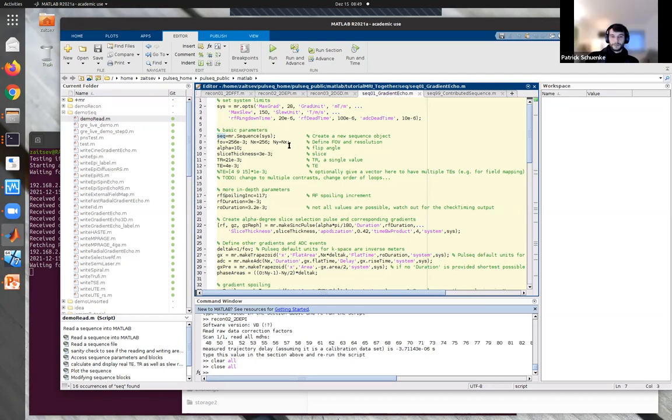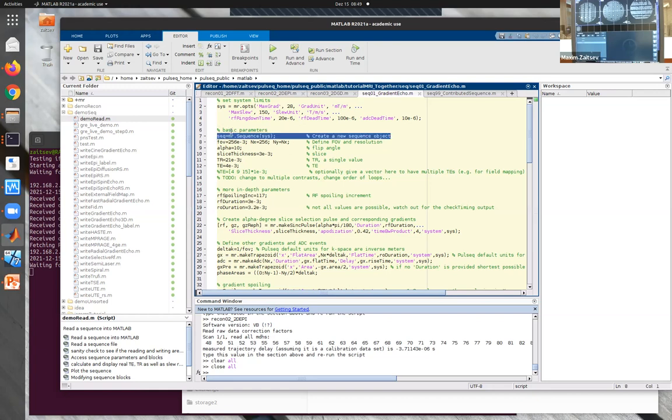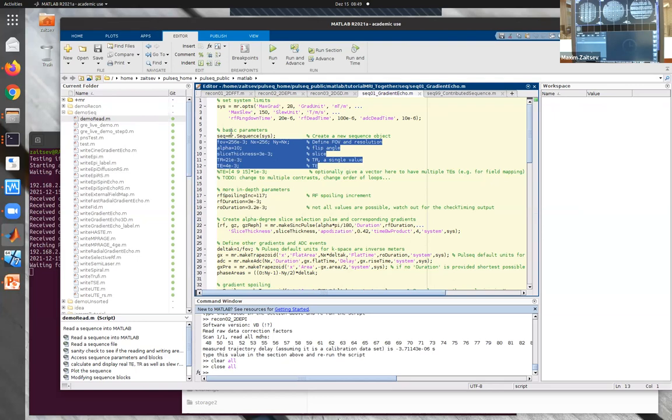Okay, so what you do then is that you define your sequence object, that is done here, and then you define some convenience parameters, but this is totally up to you. You can also just use the constant directly when you generate things. However, if you want to change something later, it's still a good idea to have things like flip angle or TE and TR on that external level.